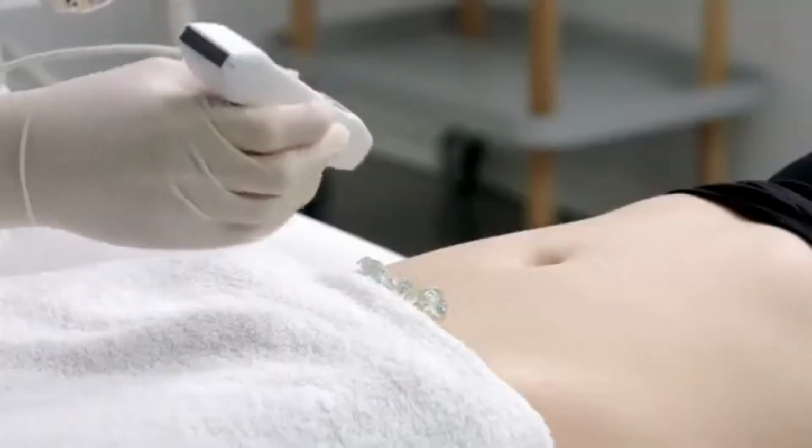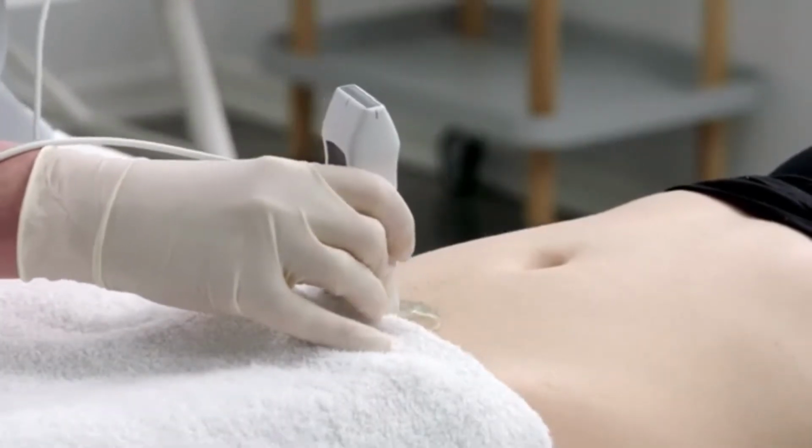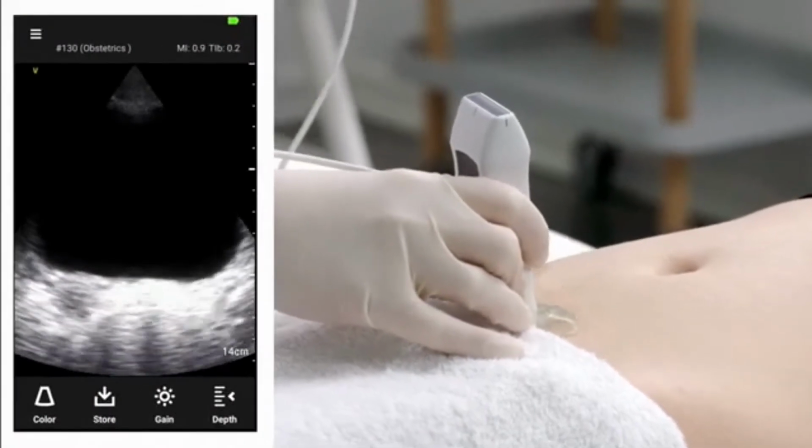Starting with the scan, I'm sure that my navigation point in a transversal plane is looking towards me. So I'm sure that it's pointing to the right side of the woman. I'll place the transducer a little bit above the pubic bone, and I start with visualizing a very nice filled bladder.